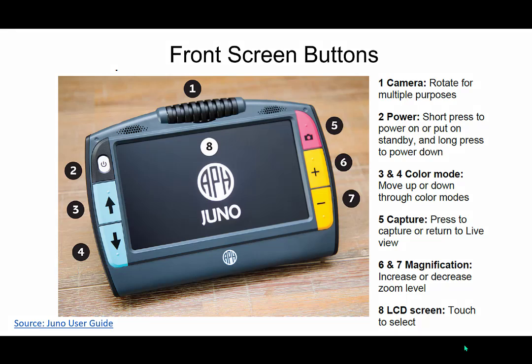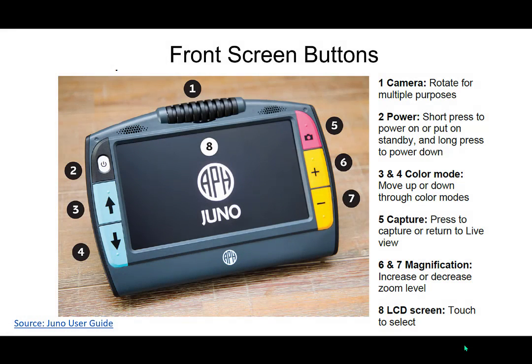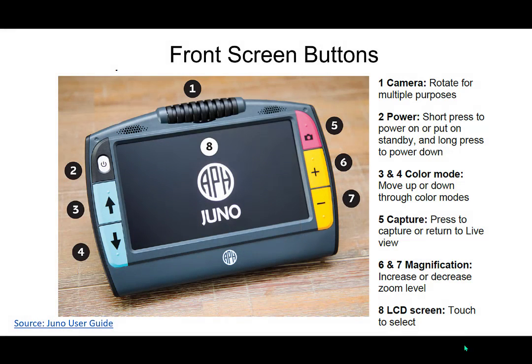If you move your hand to the top camera barrel and move it to the right this time, and around that upper right corner is a red button with a black camera symbol on it. That is the capture button. That's used to capture an image, and we'll talk about how to use that. Below that capture button are two yellow buttons, the top one with a plus and the bottom with a minus. These buttons are the magnification in and out buttons. They increase or decrease the magnification. So it's a pretty good overview of what that is.